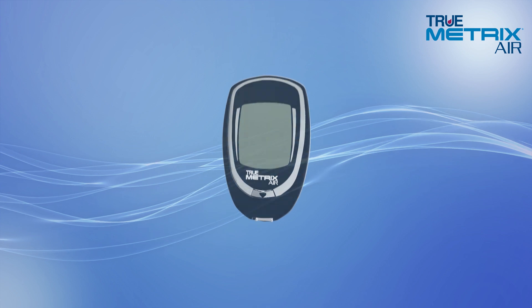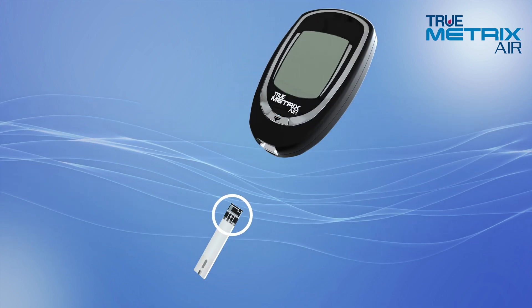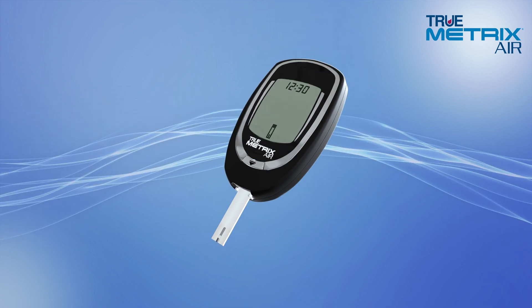With the meter off, insert the test strip contact end, contacts facing up, into the test port. The meter will turn on automatically. Make sure the drop symbol appears in the display.